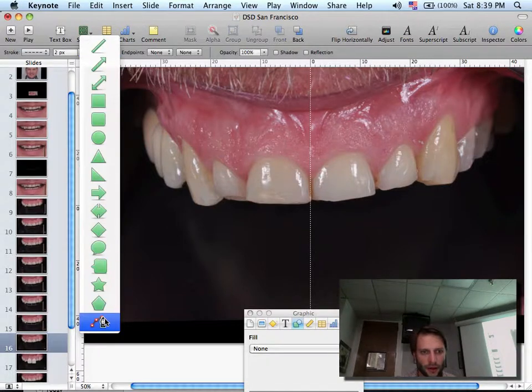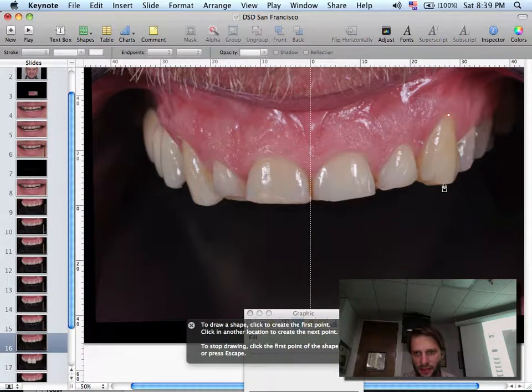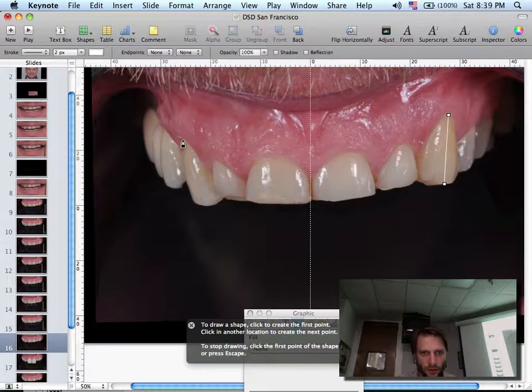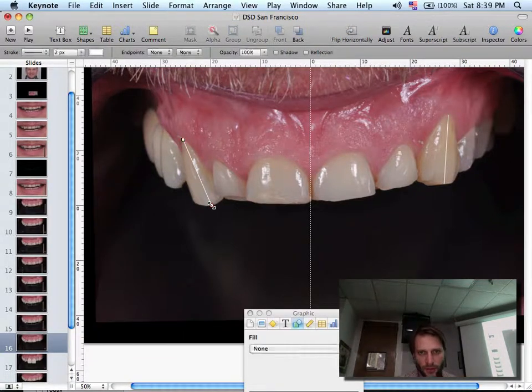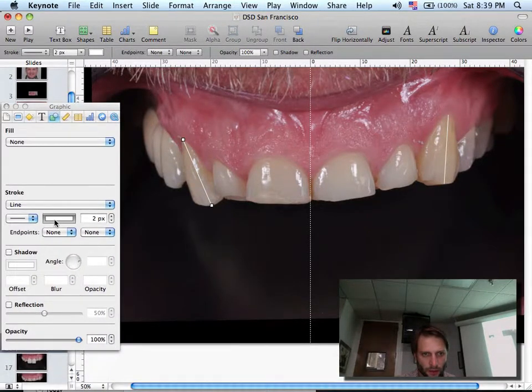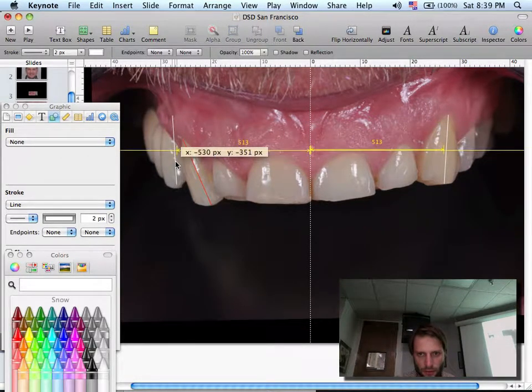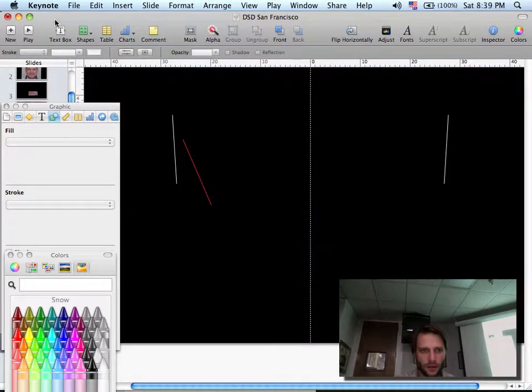If I draw this line over here, this is the position and the axis of this cuspid. And this is the position and the axis of this cuspid. Let's make it red. Now if I bring this over here and I duplicate and I flip and I do this, exactly. So now if I delete this and I show this, so you can see exactly what's going on. Now if for any instance I'm doing ortho, I can see exactly what I need to do with this to get here. So the type of movement that I need to do.